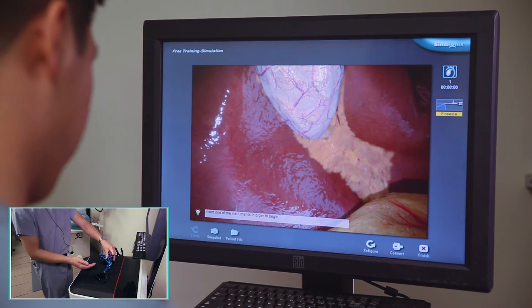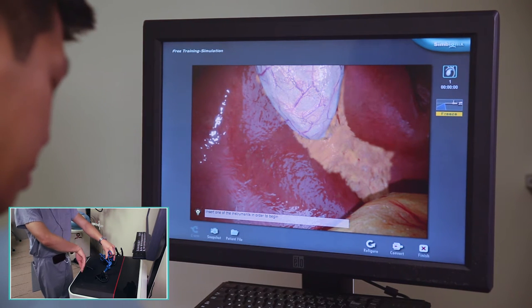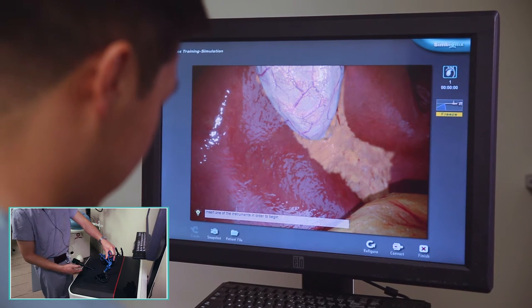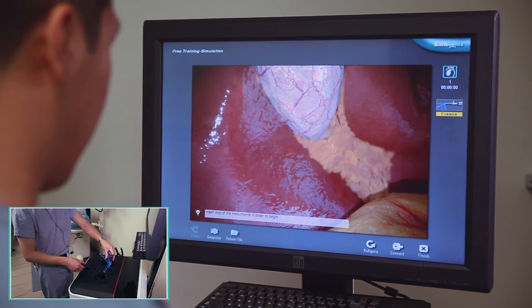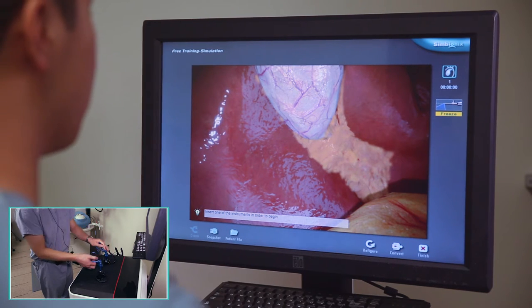It's the opposite. So if you have the light cable at 9 o'clock, then the angle of the scope will be pointed to the right. If you have it at 3 o'clock, the angle of the scope is going to be pointed to the left. For the first part of the dissection, I'm just going to have it set here with the angle of the scope pointing downwards. I've frozen the image with the button.